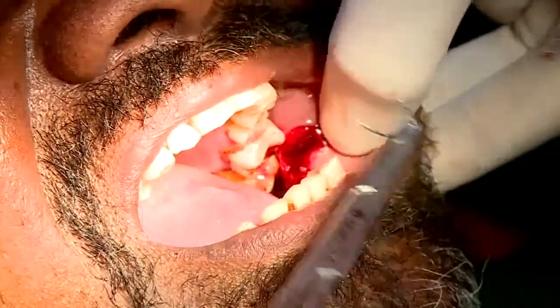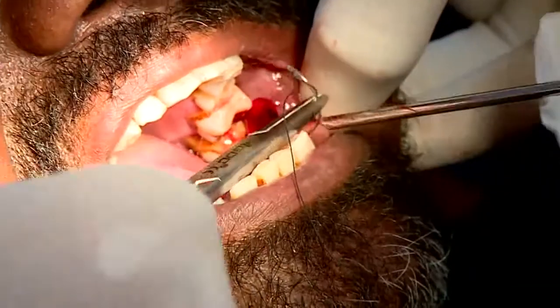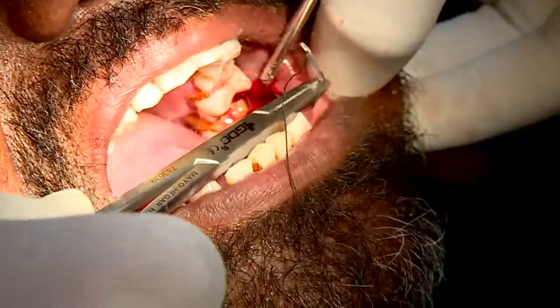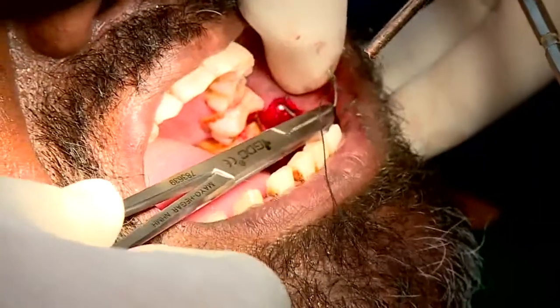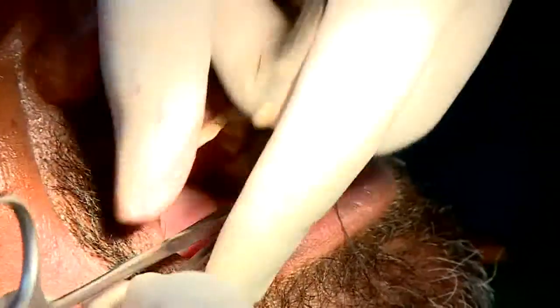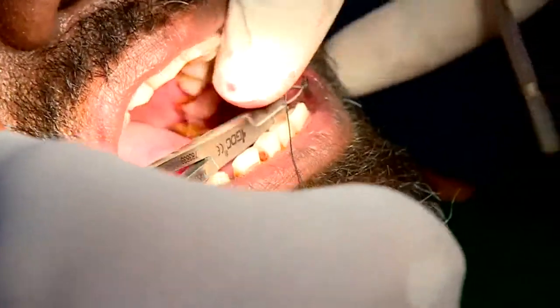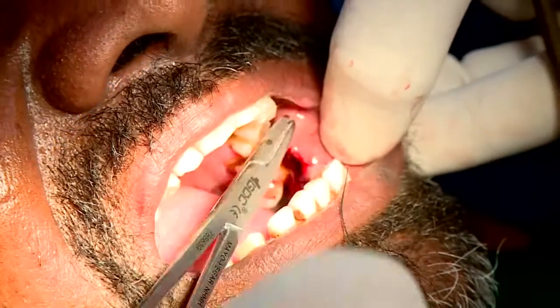Take the bite even wider away from the lesion, no problem. Here it is not about the rules of suturing, it's about closing the area without sealing the lesion into deeper planes. Since we have not given the patient a block and it's mostly infiltration, let's try to close the wound faster.